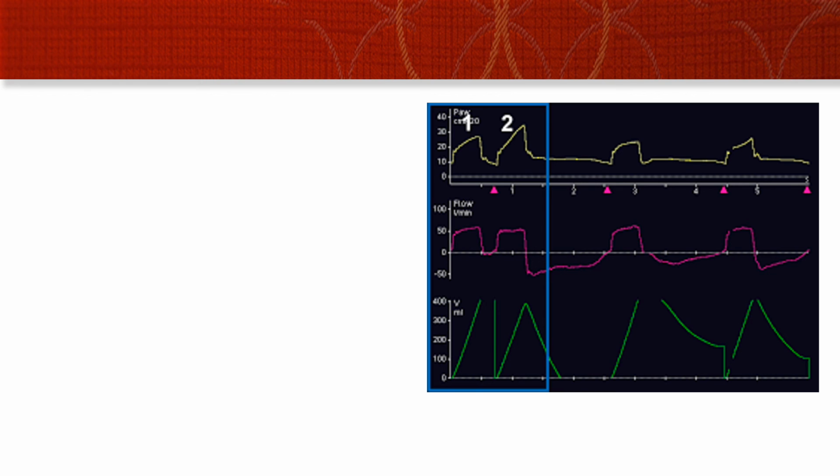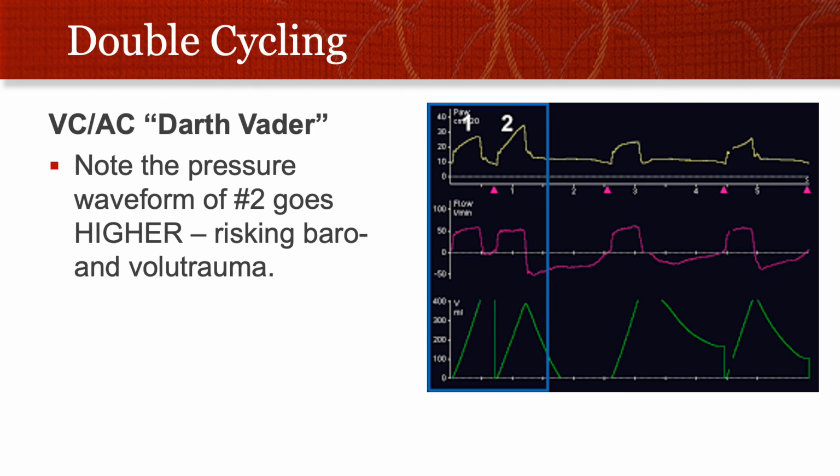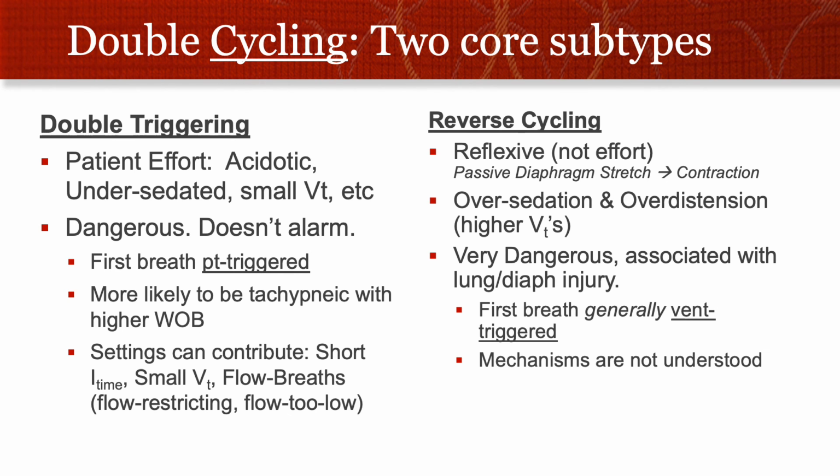And you can see here why that's dangerous. You see an uptick in the slope of the pressure waveform that goes far above what it was previously. This is quite dangerous.